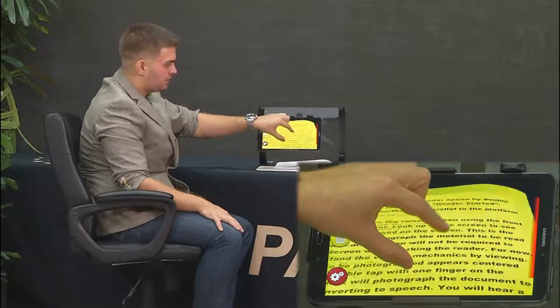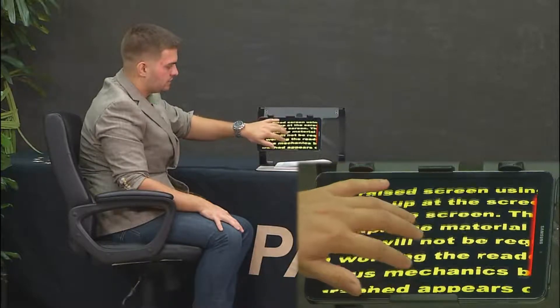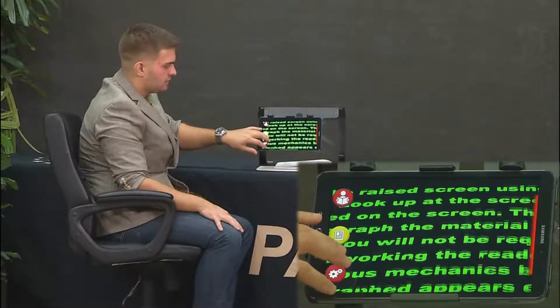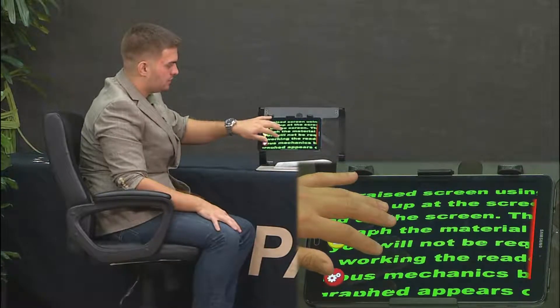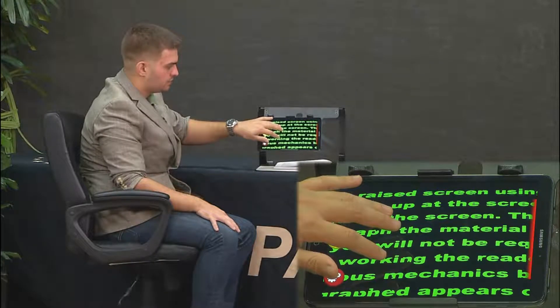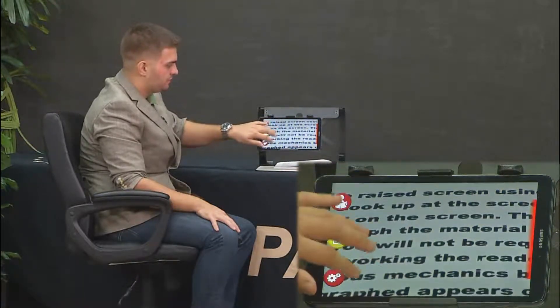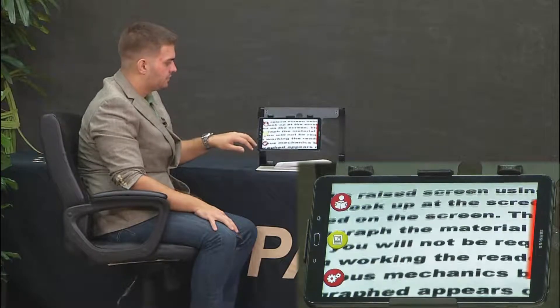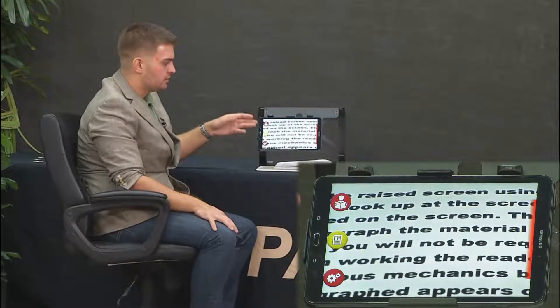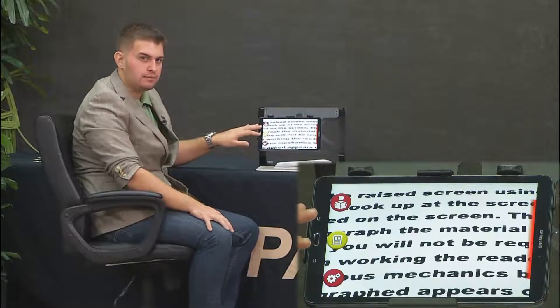Pinching in or out will zoom in or out on the document, and tapping with three fingers will change to different colors. You've got white on black, black on white, yellow on black, black on yellow, green on black, black on green, blue on yellow, yellow on blue, gray scale, original for family photos or pictures, and high contrast which is just a brighter version of true color. Then it cycles back to black on white and white on black.